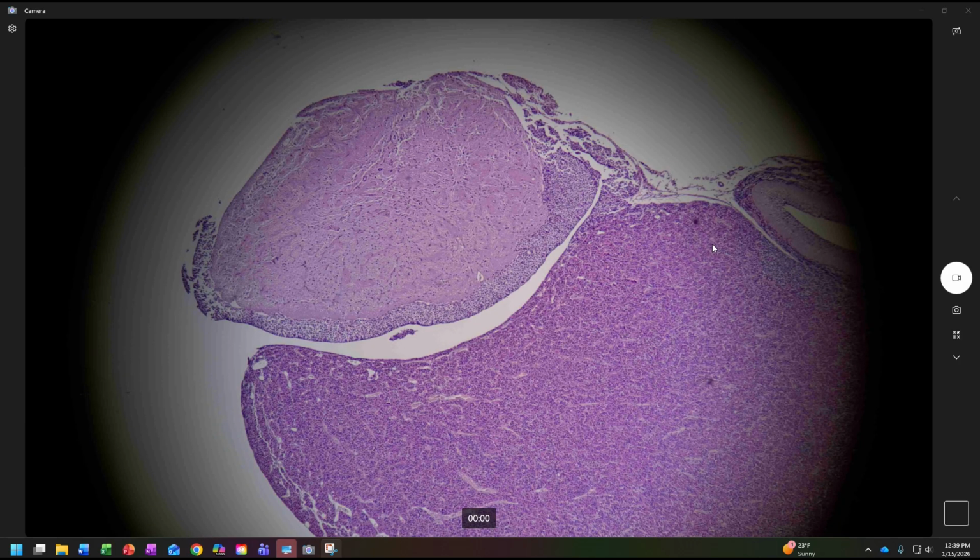We have a very distinct dark, grainy region. And then we have a little less dark, a little lighter, more wispy region. That tells us we're probably looking at the pituitary gland. Now, again, this is in the context of the three tissues we're studying. I don't know if there are any other tissues that would mimic this pattern, but as far as the three that we're studying, this is the go-to for knowing that you're looking at the pituitary.